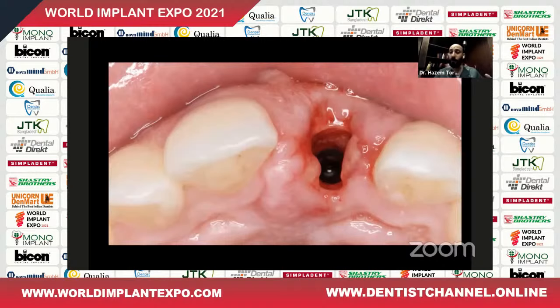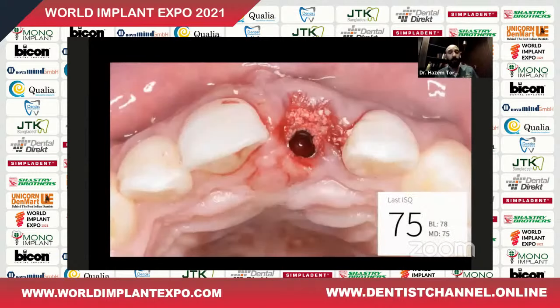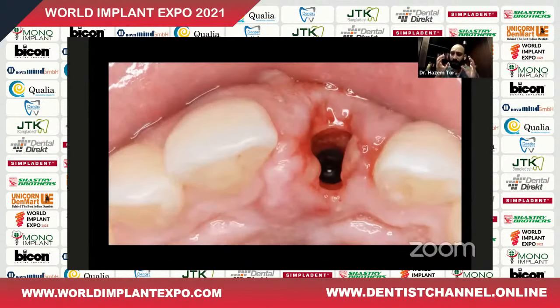the tissue, epithelial tissue, started to creep to try to close the entry of the socket with granulation tissue and blood clots. And you can see how the particulate bone is firmly attached within the granulation tissue, so it's going nowhere. You might think, well, this bone graft will fall off, even though I have a healing abutment. It won't, because the blood clot forms immediately within the first 24 hours, and you can see the bone graft is incorporated within the granulation tissue, so it's going nowhere.